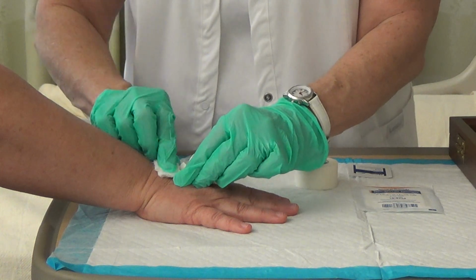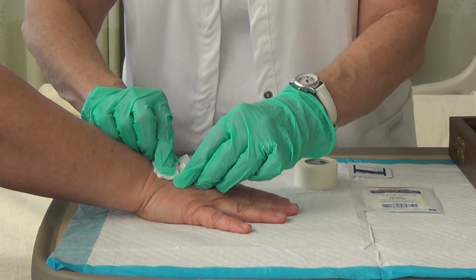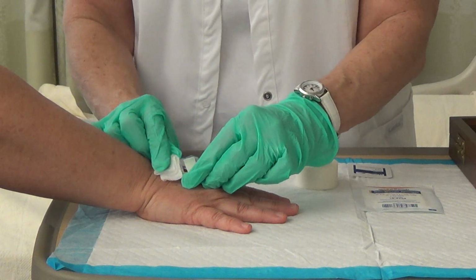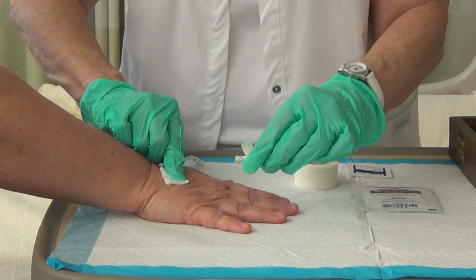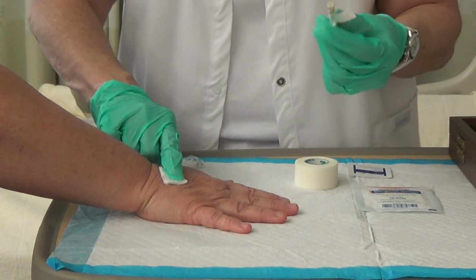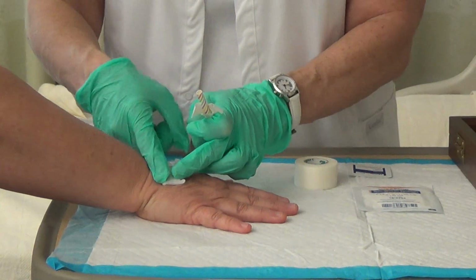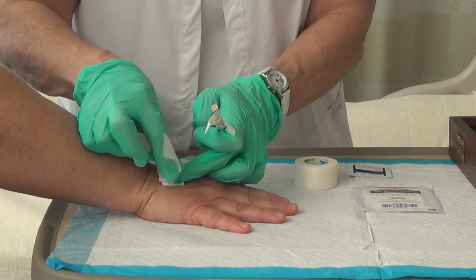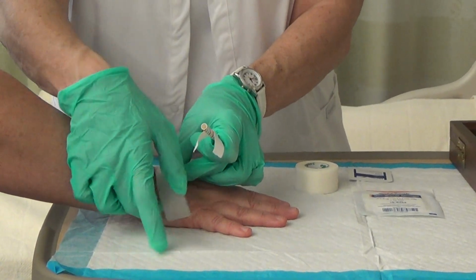I don't want to apply pressure right on the vein while the catheter is still in there, because again you're going to damage the inside of the vein. So take the needle out and then apply pressure as soon as you've removed the needle. So I would apply pressure for a little while depending on your client, and you can tape it into place and it'll stick to your gloves.